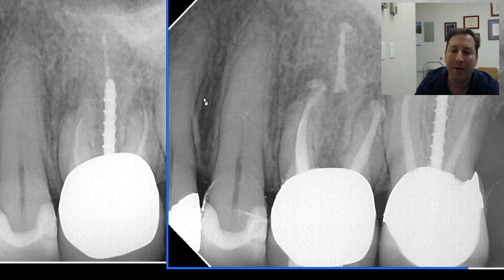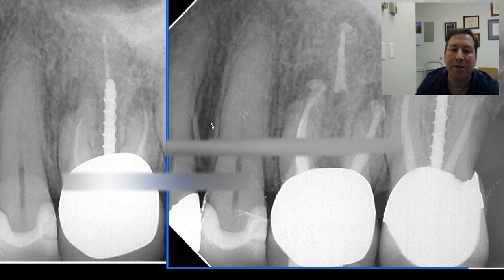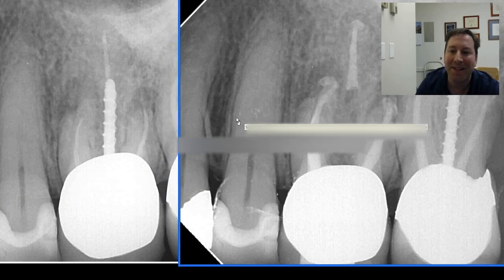I hope you enjoyed this video. I hope you took note of what to look for when it comes to finding and locating these MB2 canals. The modern standard of care is really to find MB2 canals in virtually all your molars. Oftentimes they will merge into one canal like you saw in this video. In about 50% of cases you'll see it present as two separate orifices. So if you're not finding two separate orifices in at least 50% of your cases, I want you to consider taking some continuing education courses or perhaps making use of your local endodontic specialist.